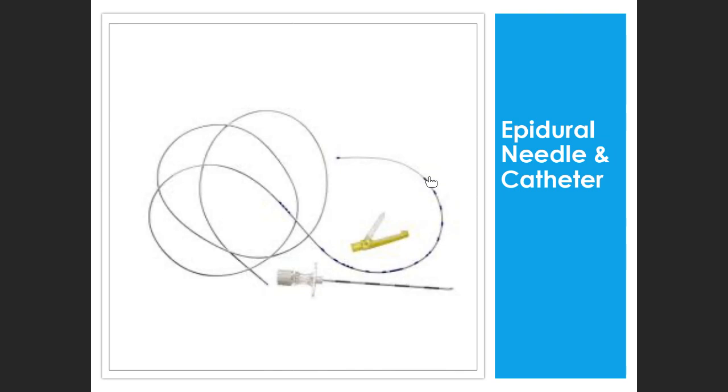This first marking would be at 10 centimeters. So when I put it in, and I put it here, at the first marking, nothing is out of the needle as yet. Okay? So I'm going to put it in to 10, and then I'm going to feed it another 3 to 5 centimeters. Sorry, the second one is 15. What did I tell you? Never mind. All right, this one, 3 to 5 centimeters in. So I'm going to have 10 centimeters and then 5 centimeters. So I have 5 centimeters in.